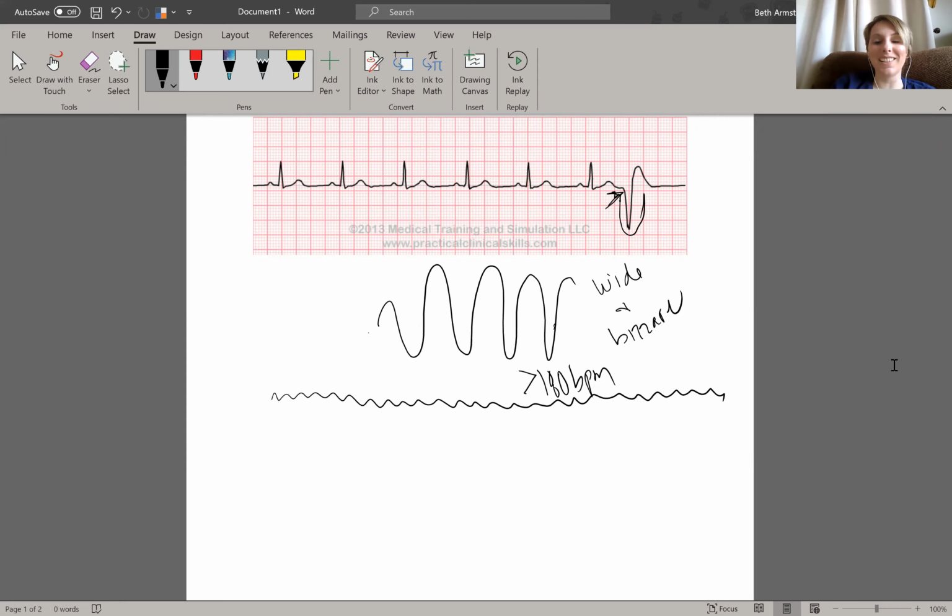So yeah, that is your ventricular fibrillation. So this would be coarse, and then they have fine, right? It's really fine. So this is when we use our defibrillator, right? We want to use our defibrillator because if we don't do something at this point, our animal's dying, right? And so after this, what's our next step?